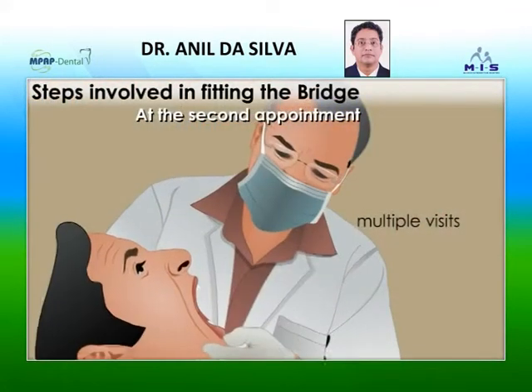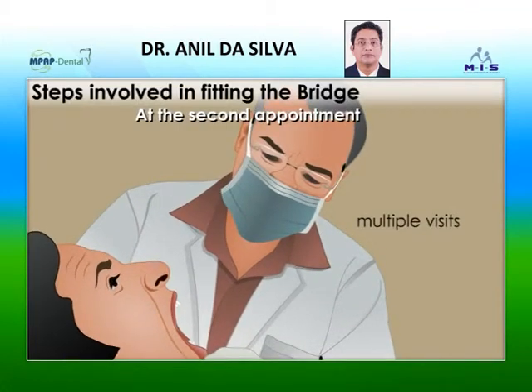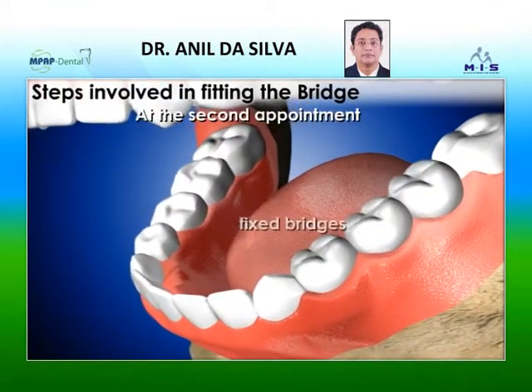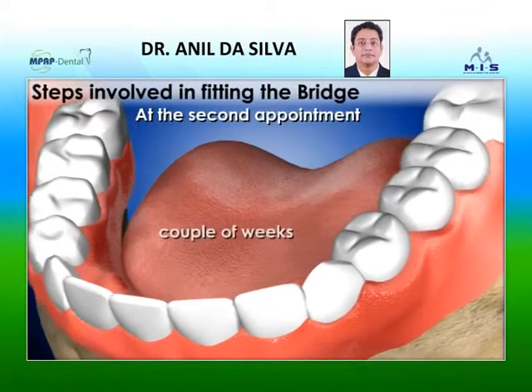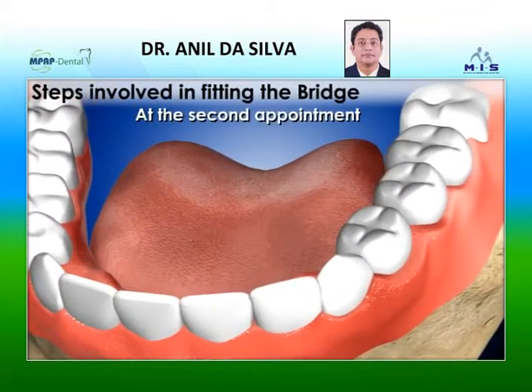Multiple visits are often required to check and adjust the fit. In case of permanent or fixed bridges, the bridge is temporarily cemented for a couple of weeks and checked for its fit.